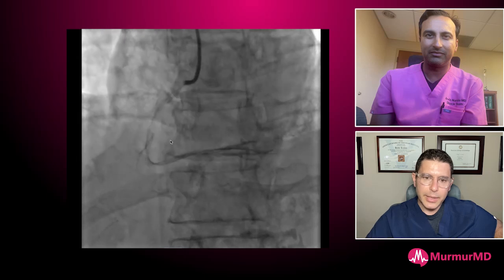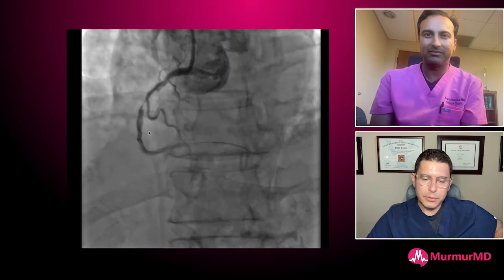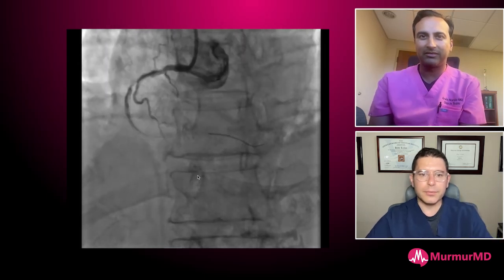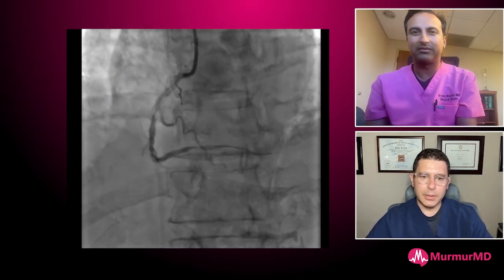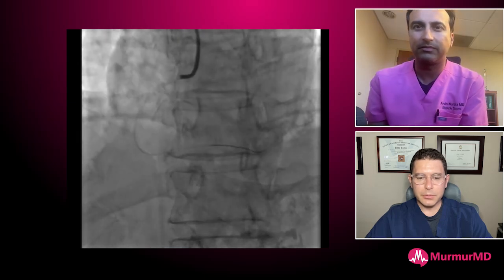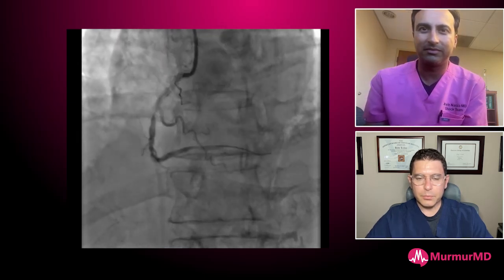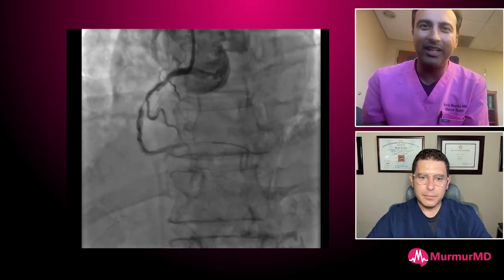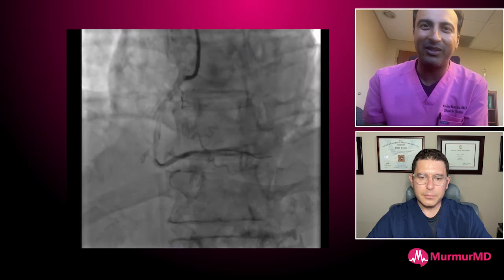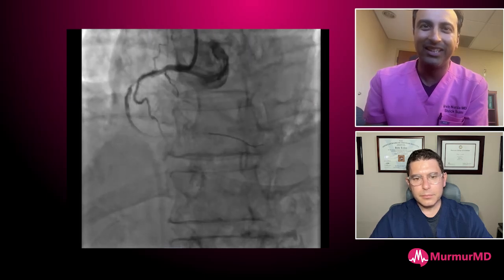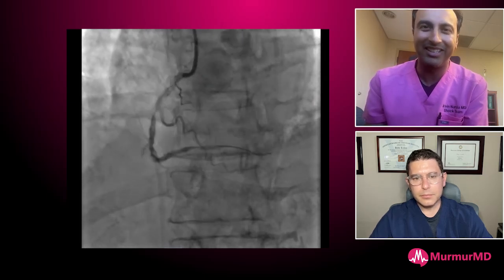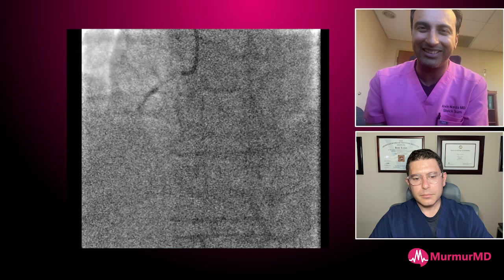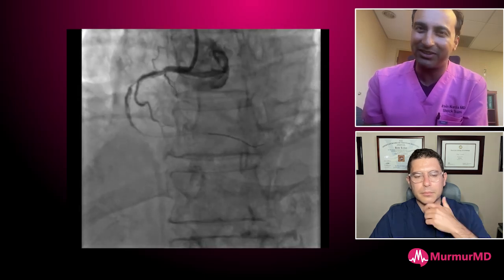We aspirated some of the clot but there is a small residual, and now we're dealing with a coral reef lesion — not the typical STEMI situation. What options are available? One option is to take your imaging catheter down: if it won't cross, it's calcified and tight and needs some kind of modification.